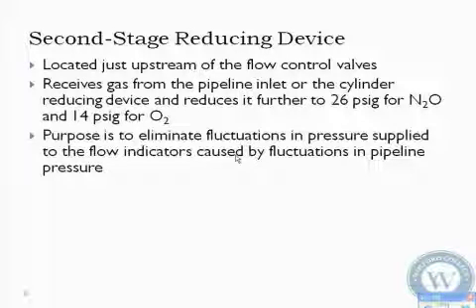It's located just upstream of the flow control valve, just beneath your flow meter. And you're going to get a reduction to 26 psi for nitrous and 14 for O2. So you need to know that.